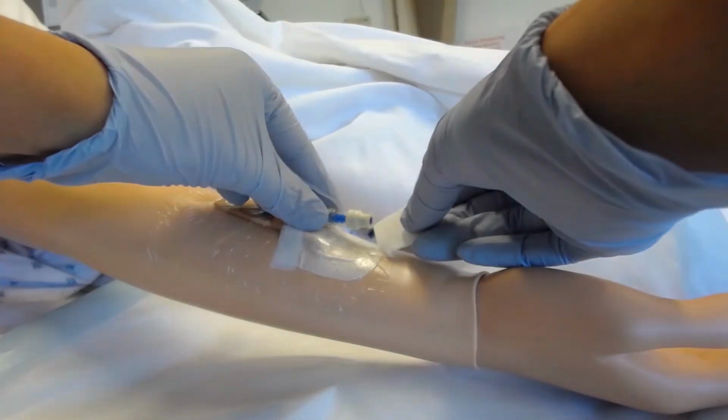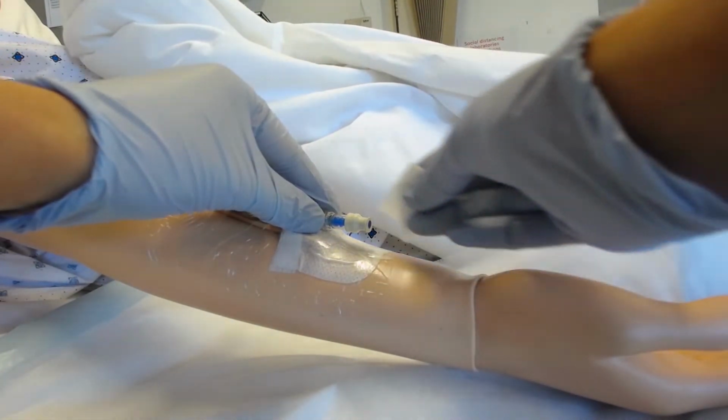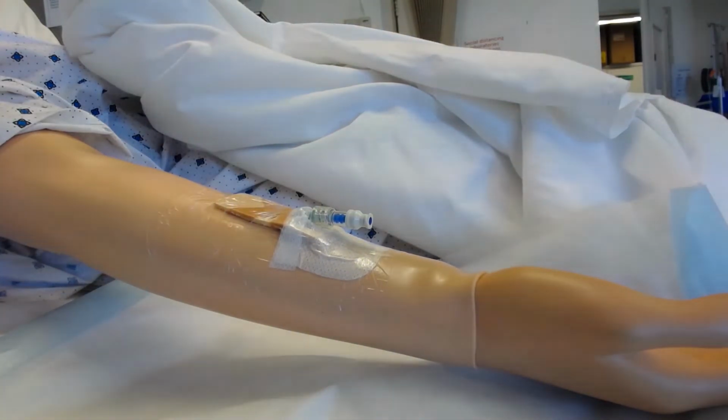When supporting the cannula with your non-dominant hand for swabbing and connecting, ensure you are just holding it gently, not pulling it or moving it, so that you're not causing trauma or pain to the patient.